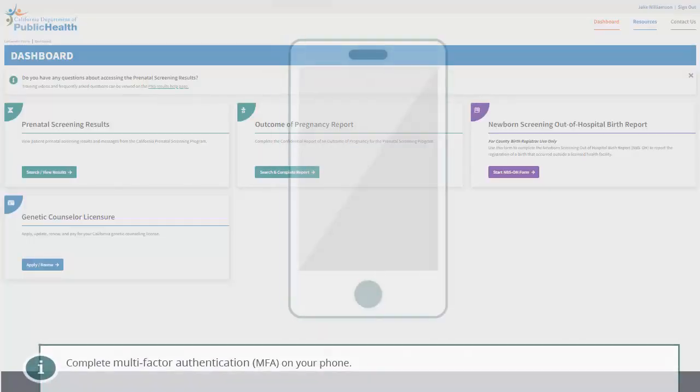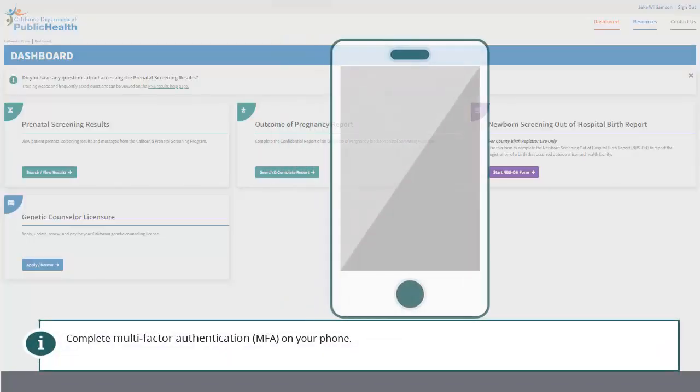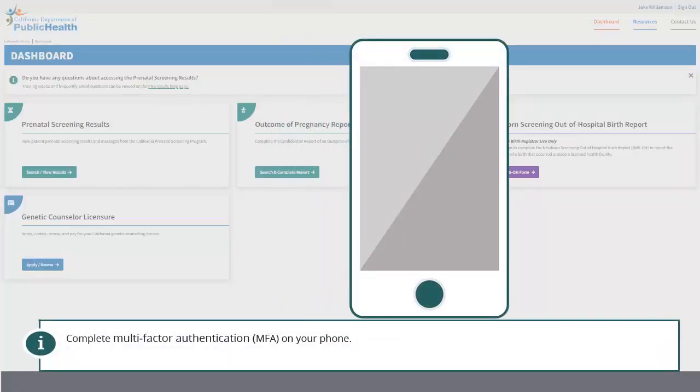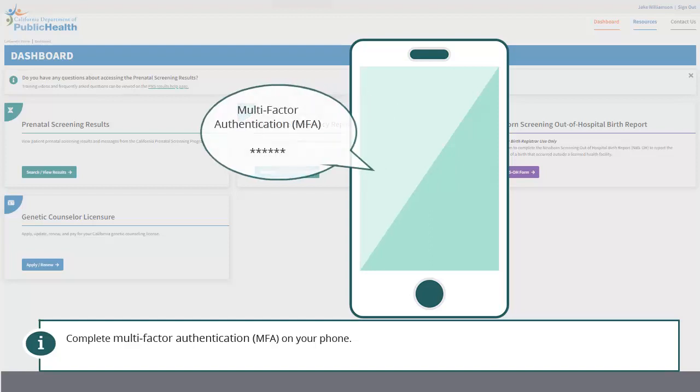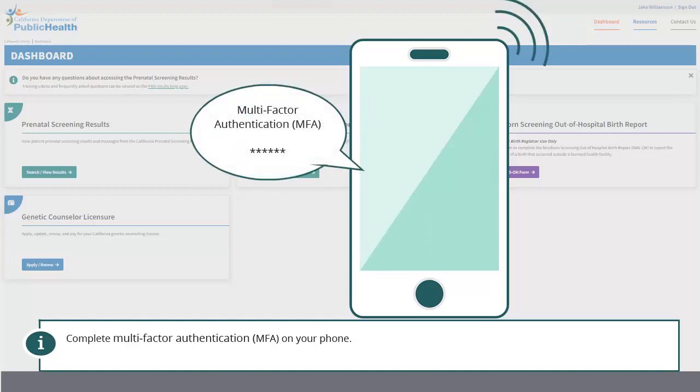When signing in after the initial access, you will be asked to enter your phone number, which will be stored to confirm your identity with a code sent to you via phone call or text as a form of multi-factor authentication. Once you verify your account via MFA, you will be successfully signed into the CalGenetic Portal and will land on the dashboard screen.